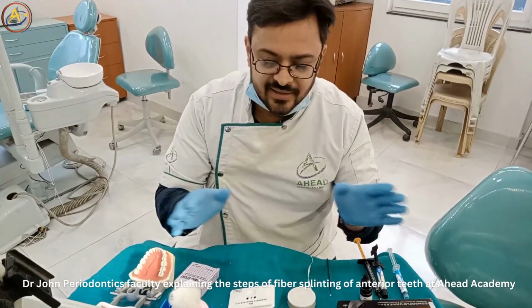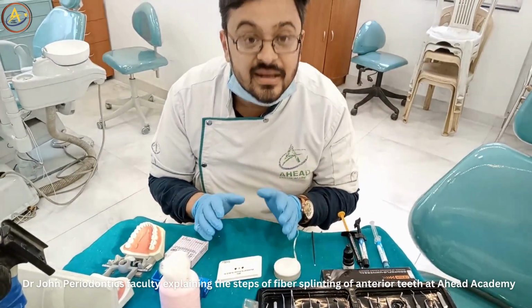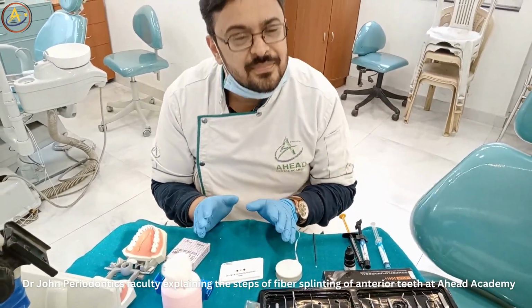Okay. So as you see, we have today all the equipment for splinting. Okay. So now, what is splinting?